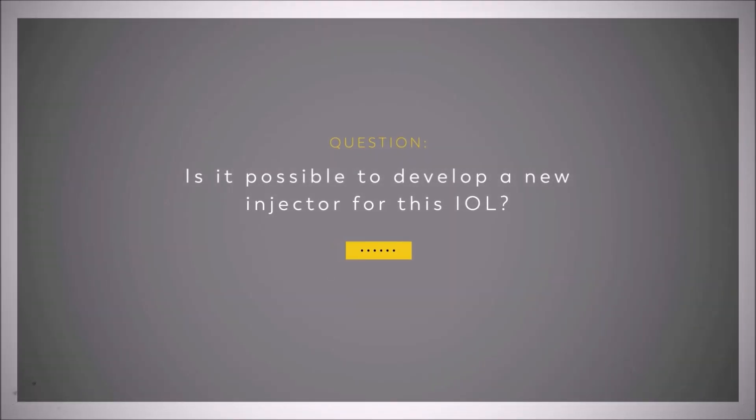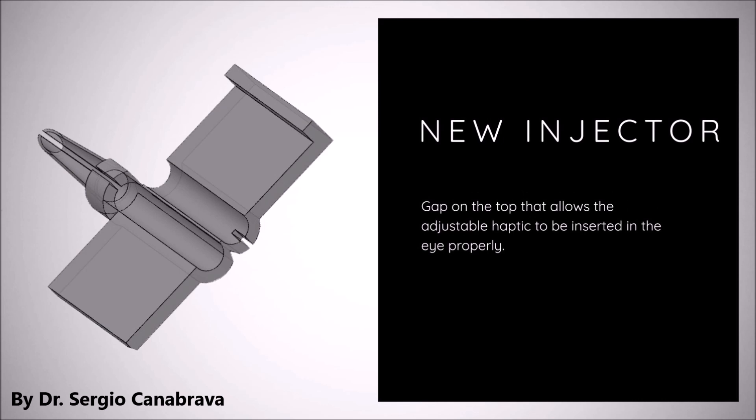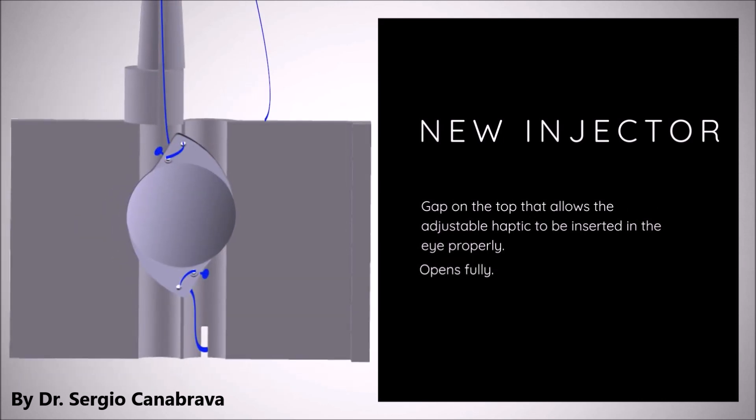Is it possible to develop a new injector for this IOL? For the first time in ophthalmology, we present this new concept of injector with a gap on the top, that allows the adjustable haptic to be inserted in the eye properly.